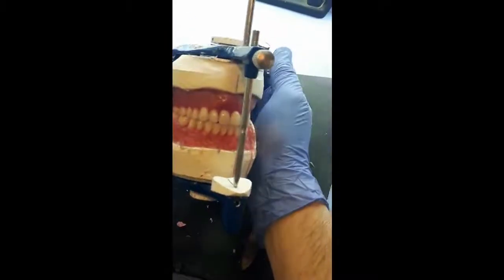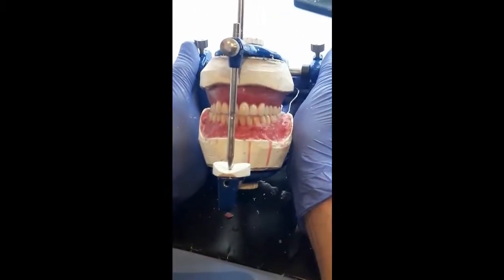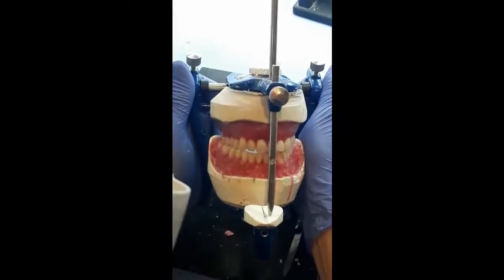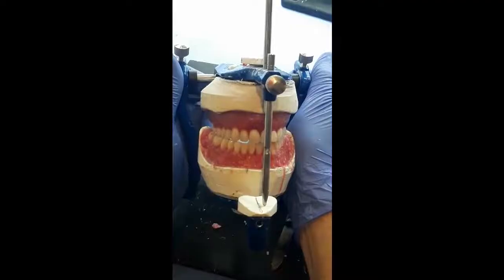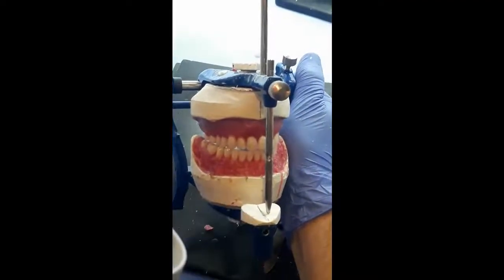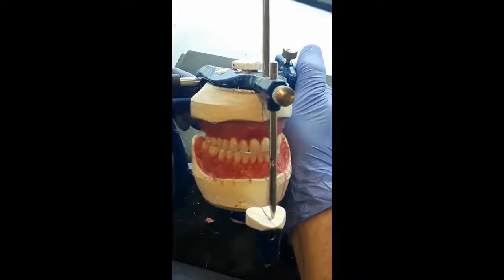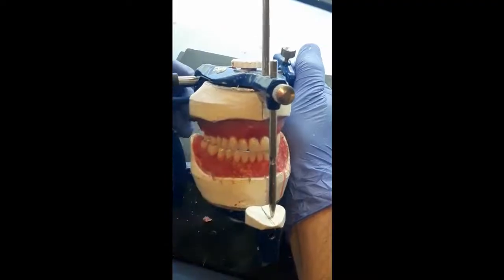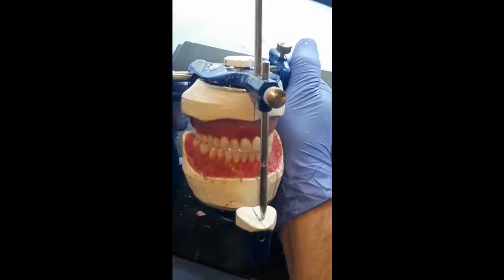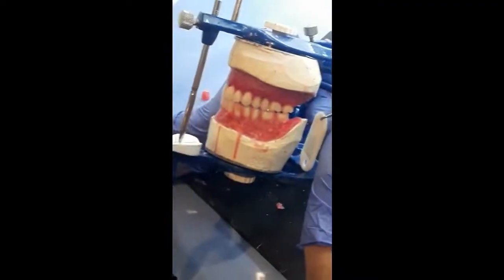Okay, and I want to now check the lateral movements, lateral excursion, eccentric movements. Here is the working side, and you can notice that the pin is not separating from the incisal guidance table, and I have working contacts between the buccal cusps of the maxillary and mandible, and on the other side I have multiple balancing contacts.